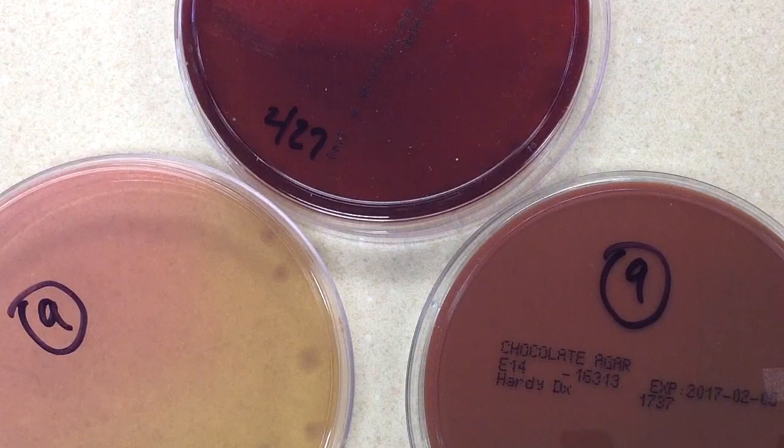The tech saw gram negative rods. So with a positive blood culture, we do think of microbiology as having panic values. In other areas of the laboratory — for example, chemistry — if we have a low or high potassium or glucose, we know we have to call the physician. But in microbiology, there are definitely panic values that need to be called to the physician, and a positive blood culture is one of them.